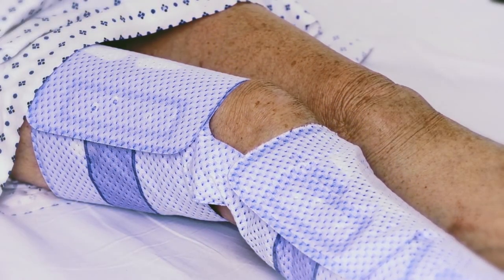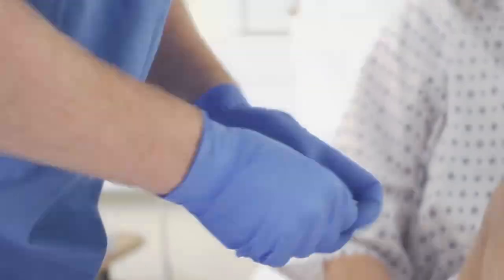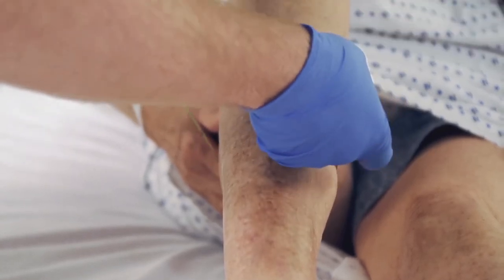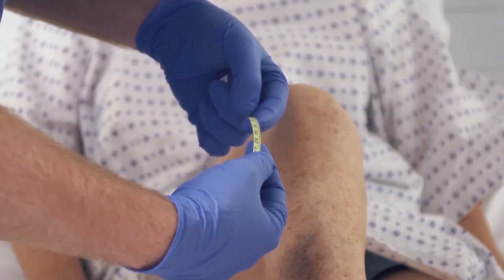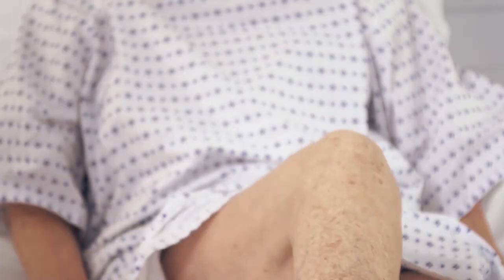For knee length sleeves, measure the circumference of the patient's calf at the widest part, and then refer to the Kendall SCD system sizing chart to determine the correct sleeve size.